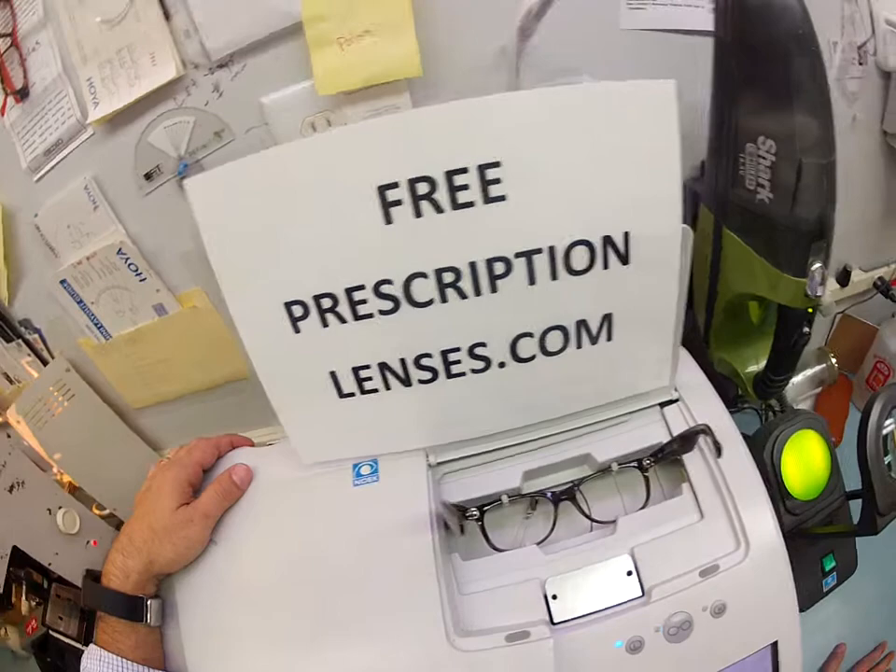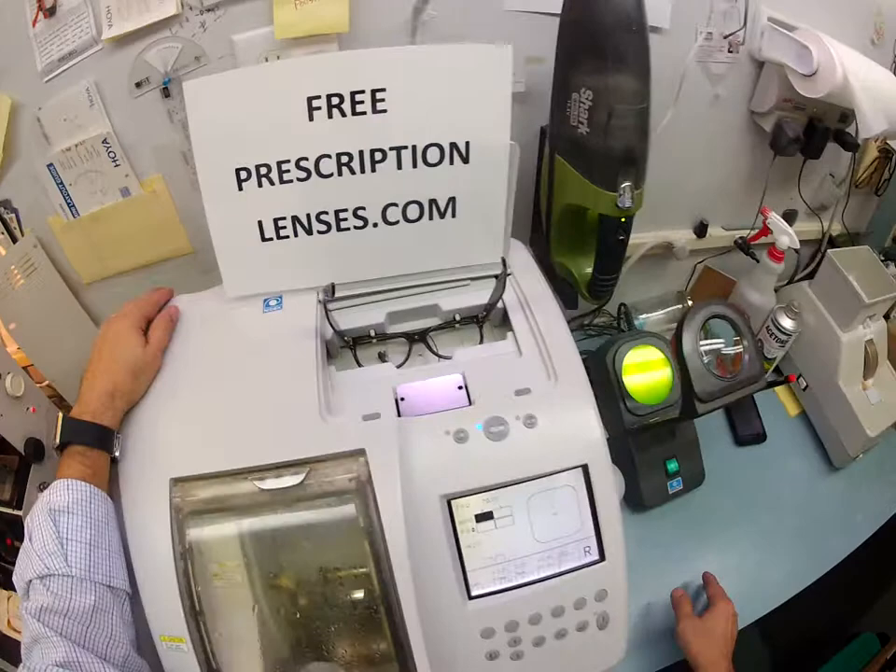Here at FreePrescriptionLenses.com where everyone loves a bargain and no one is disappointed with quality. You buy the frame from you, you get free clear prescription or non-prescription lenses. Kenny, all you did was pay the upgrade to the transitions and the anti-glare.